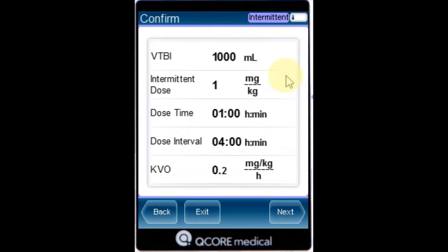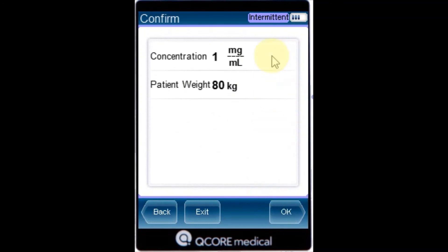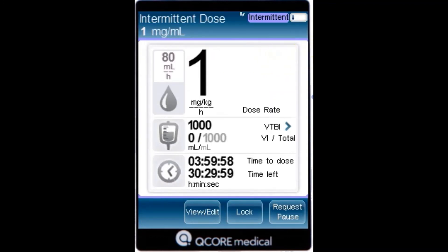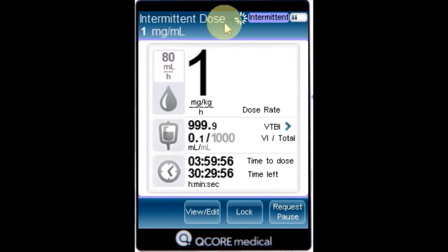Review the parameters displayed in the confirmation screen and then press OK. To begin the infusion, make sure that all clamps on the administration set and any other connected devices are open and press start. The intermittent dose screen is displayed and the infusion begins with the first dose.